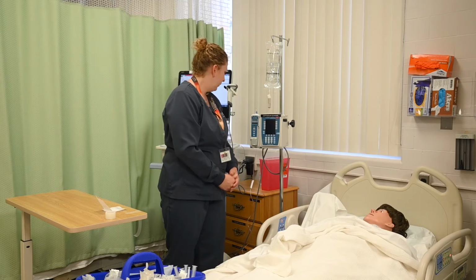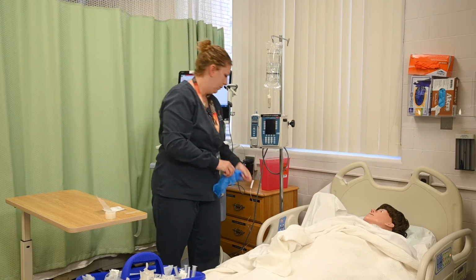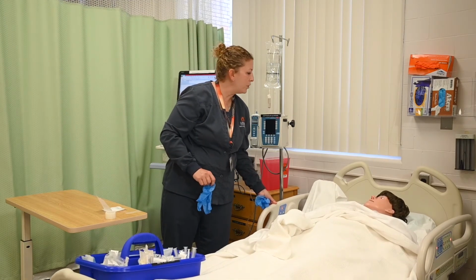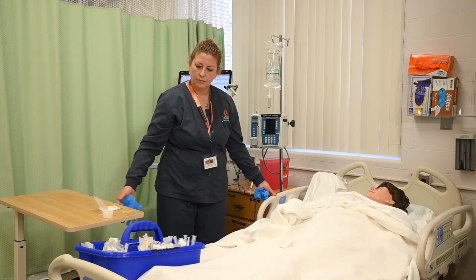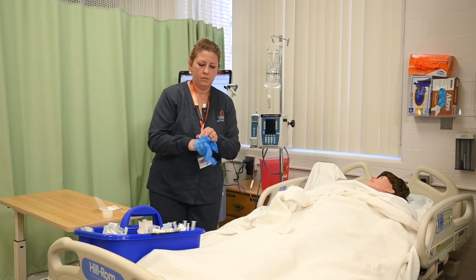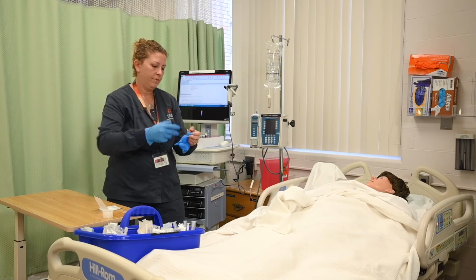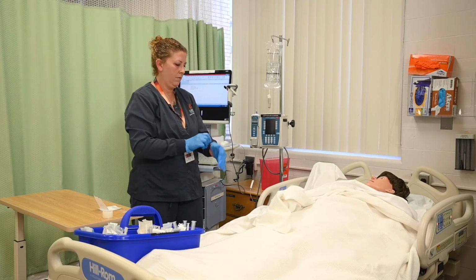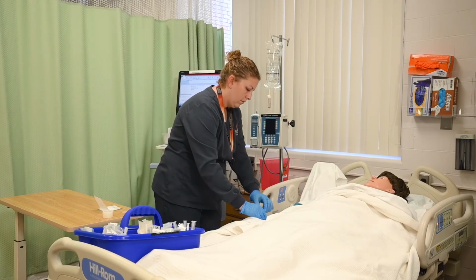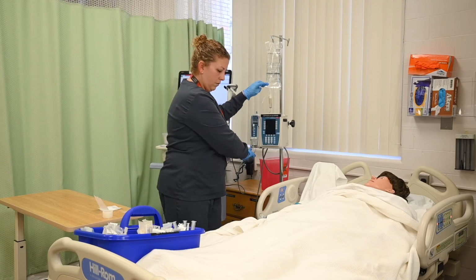Prepare all supplies and equipment using aseptic technique. Apply clean gloves. And raise the bed to a comfortable working height. Just going to put your bed up. Remove IV site tape and dressing, securing the IV catheter with one hand.